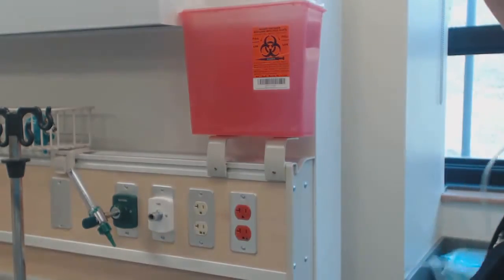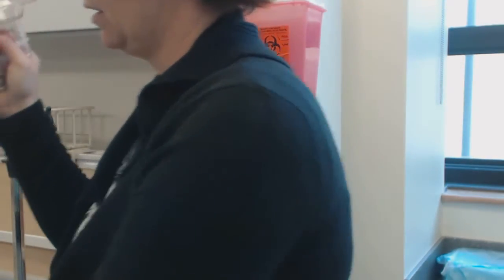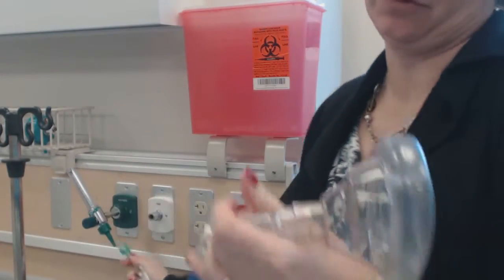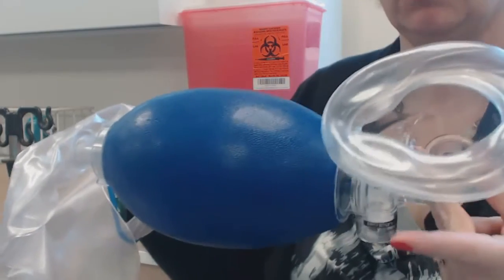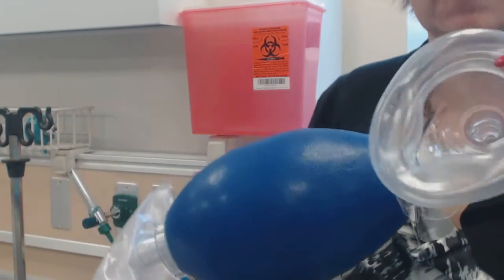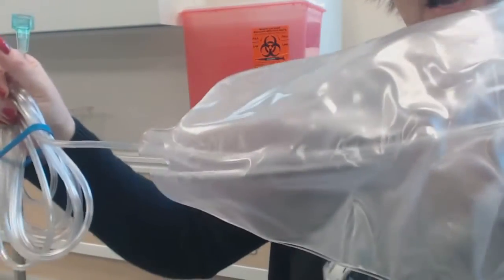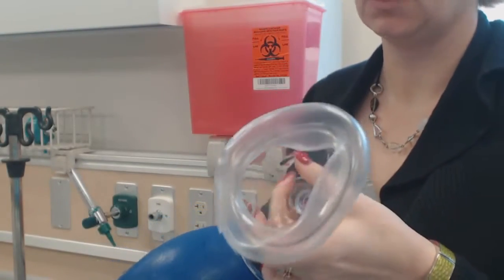When the patient cannot maintain their own respirations, that's when we assist them. If the patient's respiratory rate falls to a dangerously low level — say seven or eight — or they're not being effective, with a respiratory rate of 30 or 40 and very low sats, you know you have to assist their ventilations with an Ambu bag. This is the mask, there's the balloon, and then a reservoir that holds oxygen.